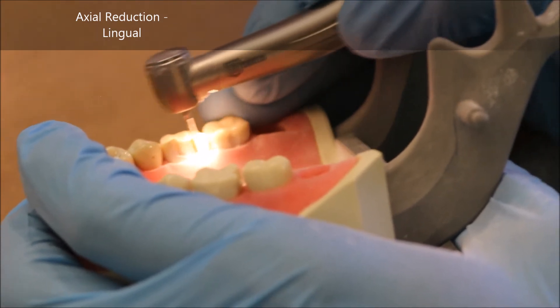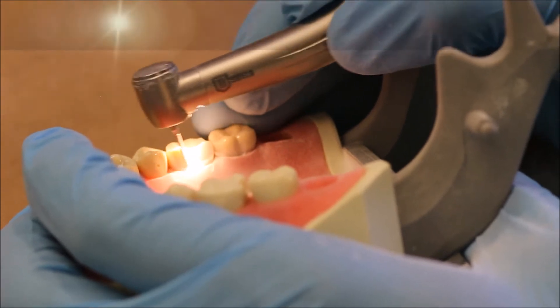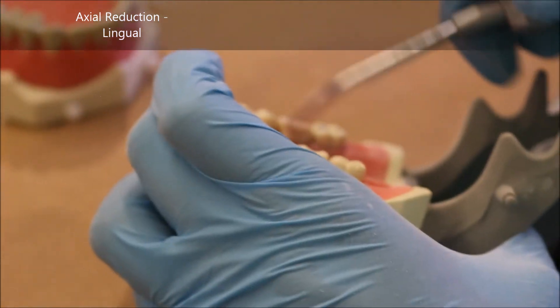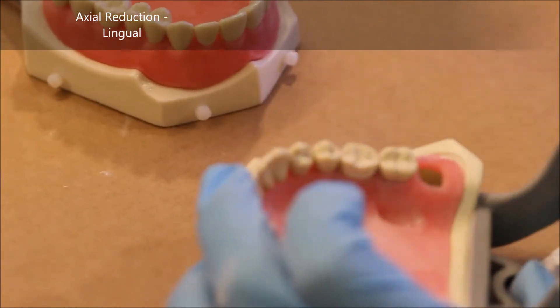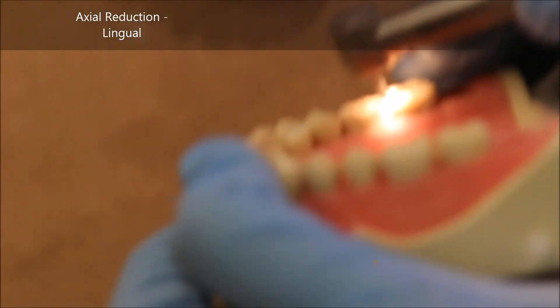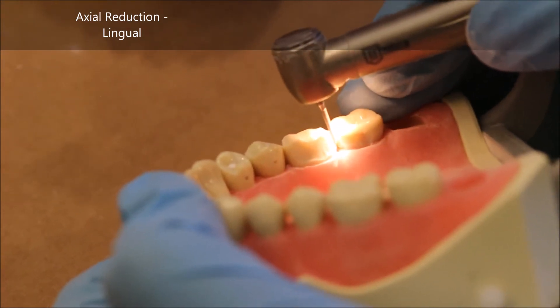Here you can see me try to take the chamfer as far into the interproximal as I can. But the 878 is not going to be the burr I use to break through the contact. There's very little of the interproximal left now on the lingual side, so I switch back to my 850 and I'm ready to go through the distal.